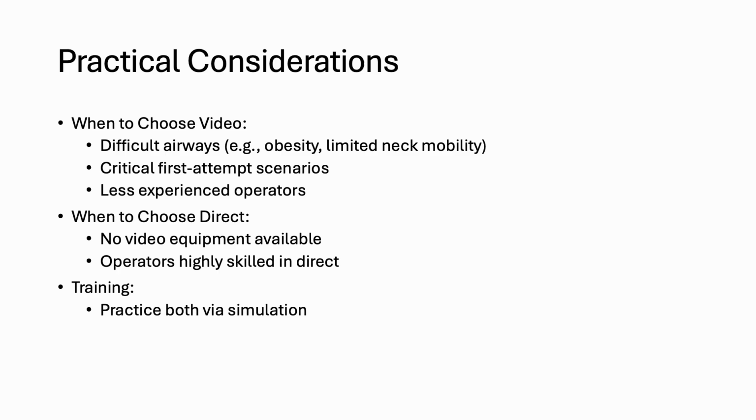Direct laryngoscopy still has its place. If video gear isn't around or you're a pro with direct, it's reliable. Practically, many sites are shifting to video as standard, but we must stay sharp with direct for emergencies. Simulation training is gold. Practice both to handle any scenario.